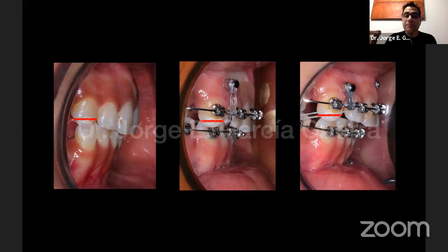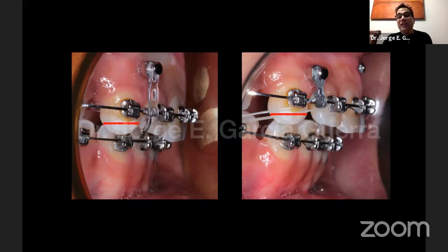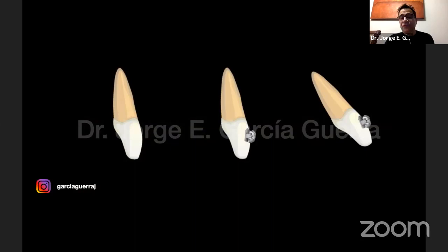So this helps us very much to do some simple mechanics. You can also do it with some utility arches, but for me it's easier to put in an implant than to bend wire. Okay. So this is what we changed, the inclination of the teeth prior to the space closure.